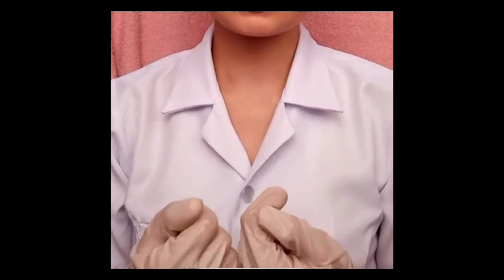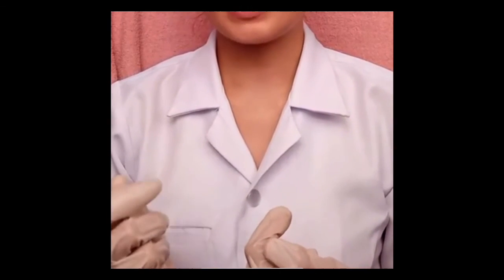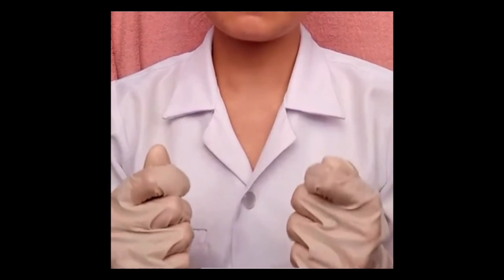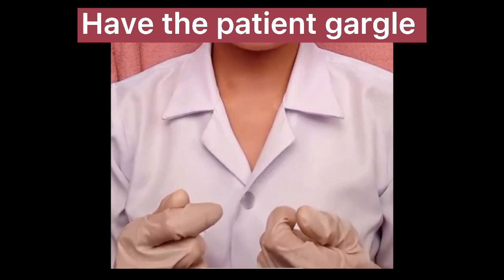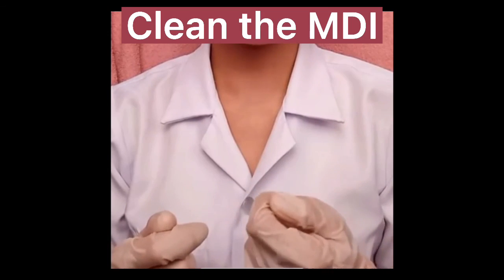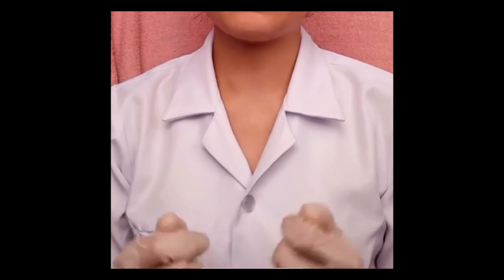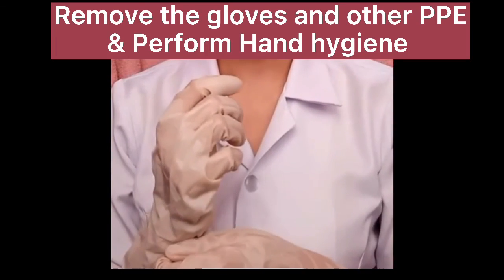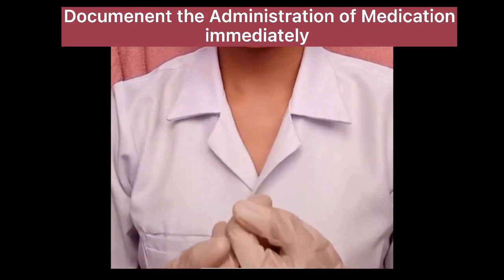After the prescribed number of puffs has been administered, have the patient remove the MDI from the spacer and replace the caps on both. Next, have the patient gargle and rinse with tap water after using an MDI as necessary, and clean the MDI according to the manufacturer's directions. Next, remove the gloves and additional PPE if used and perform hand hygiene. Then document the administration of the medication.